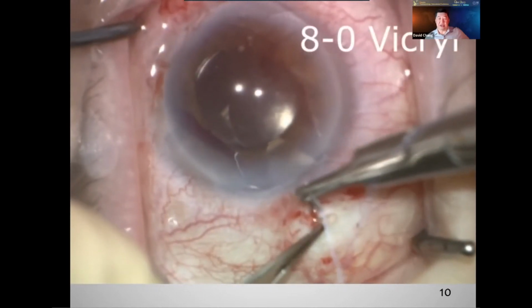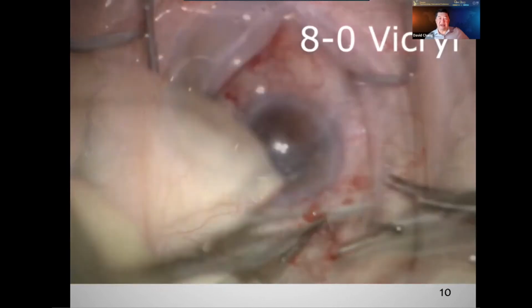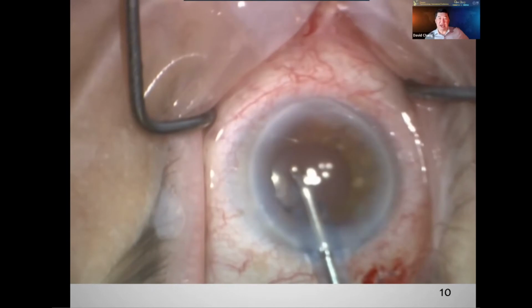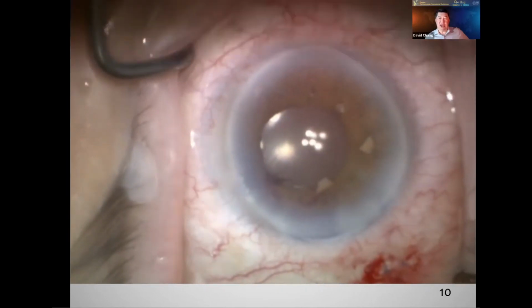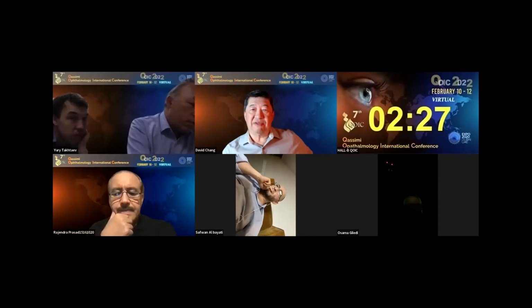And there we go. So, this one does have the advantage with pars plana. It's an anterior vitrectomy, but we have the right angle of approach, and we can, again, avoid losing the viscoelastic trap. So I'll end my video there.